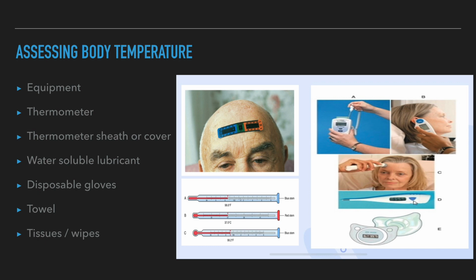Disposable thermometers are very convenient when infection control is a concern because they are discarded following a single use. These thermometers are available with readings in Celsius or Fahrenheit and are reported to be accurate. For oral temperature measurement, they are placed deeply in the sublingual pocket and left in place for 60 seconds. When used for axillary temperatures, the strips are placed vertically against the trunk of the body and held in place by the upper arm for 3 full minutes.